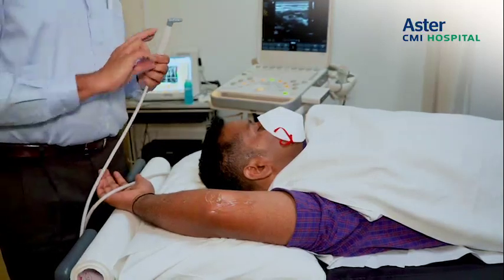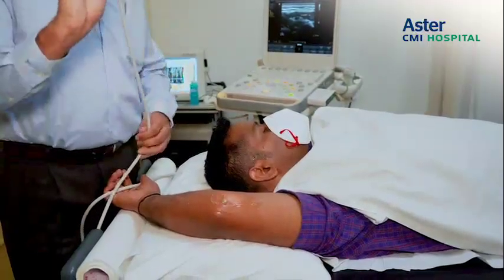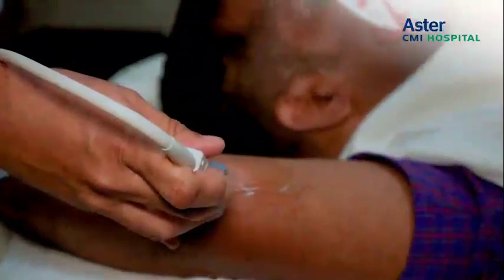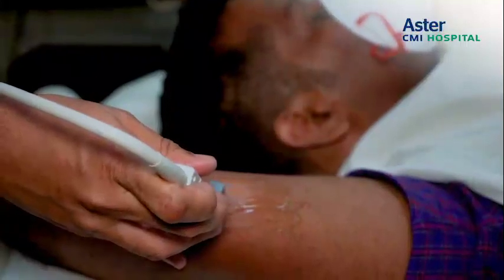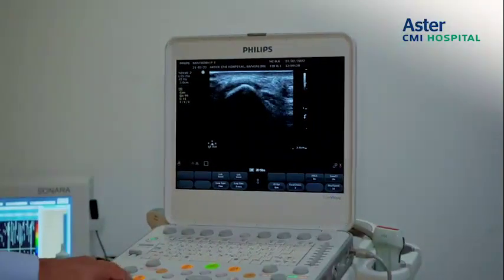One of the novel applications of neurosonology is the tracking of peripheral nerves. This is the hockey stick probe which I had mentioned earlier. So far, the evaluation of peripheral nerve disorders has been clinical examination and nerve conduction studies. Now with this neurosonological application, there is peripheral nerve ultrasound, and we can visualize the nerve.